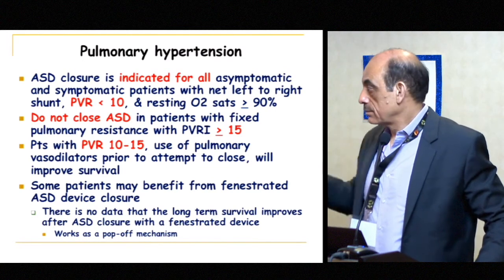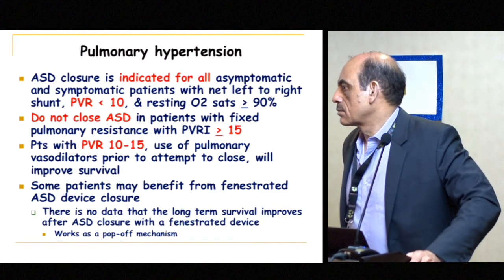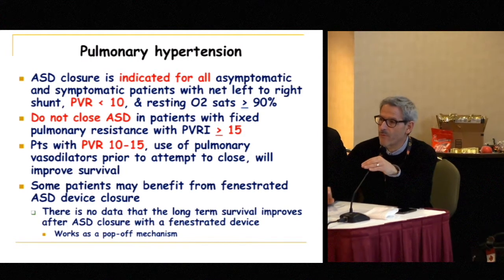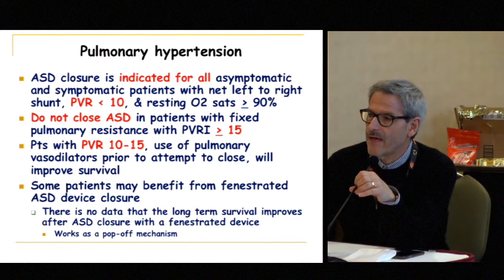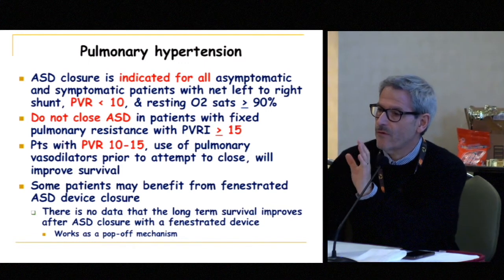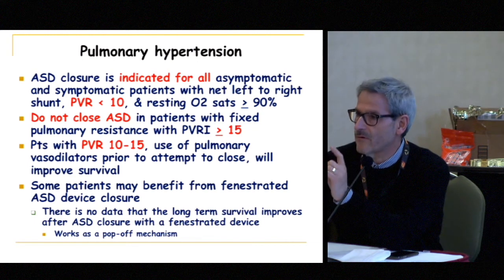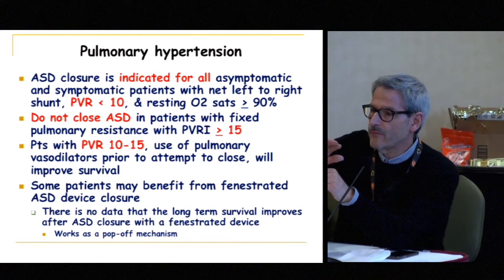Just as a comment on what John mentioned about TE echo or not looking at the echo and doing fluoroscopy, I think one thing that's really important when you close ASDs is to always do it the same way. Always use the same projection so that when you put the device in and look at it on fluoroscopy, you know it's in the right spot, or you know something's wrong. Particularly the anterior rim.